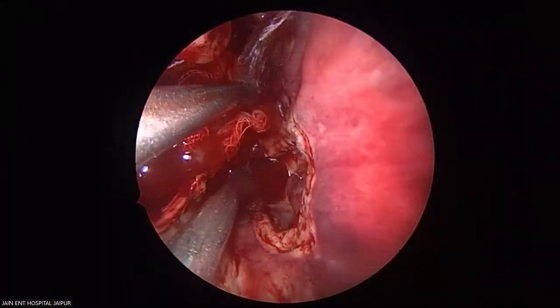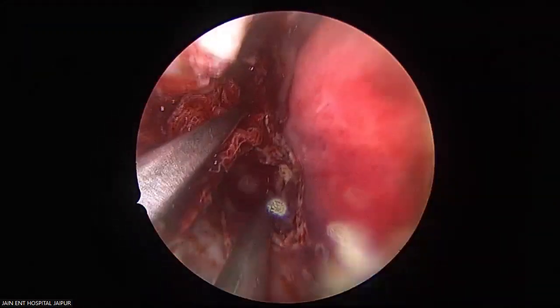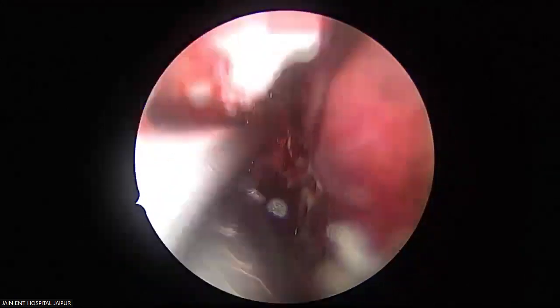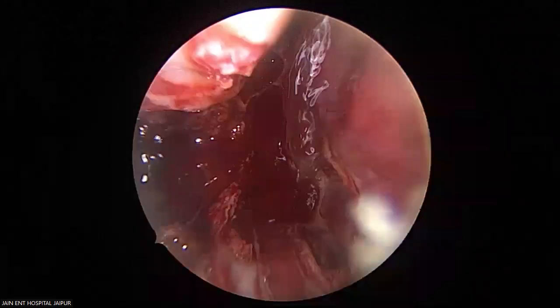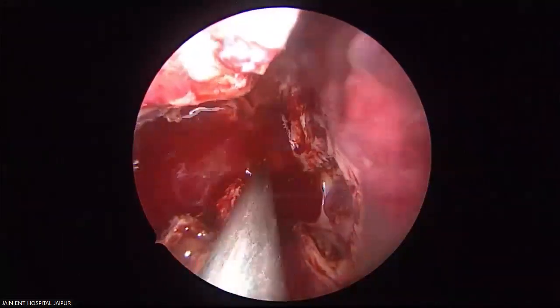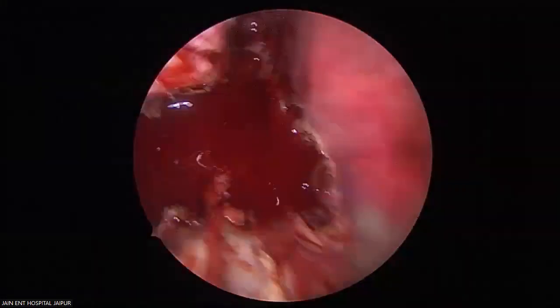See now the nasal cavity is opened up again. Remove this lateral peg. Give me a wash. Give me suction. Come out the bleeder, the lateral part.